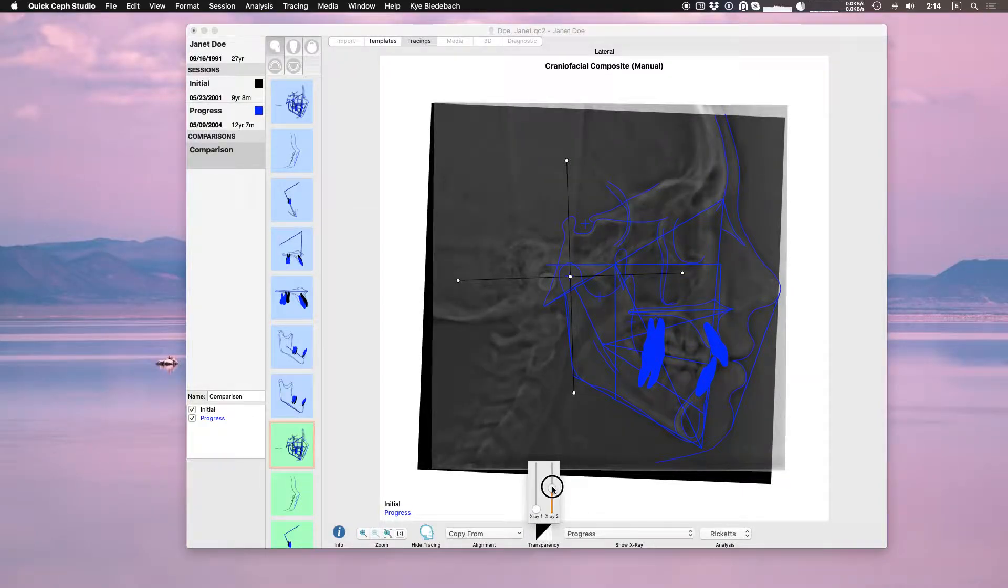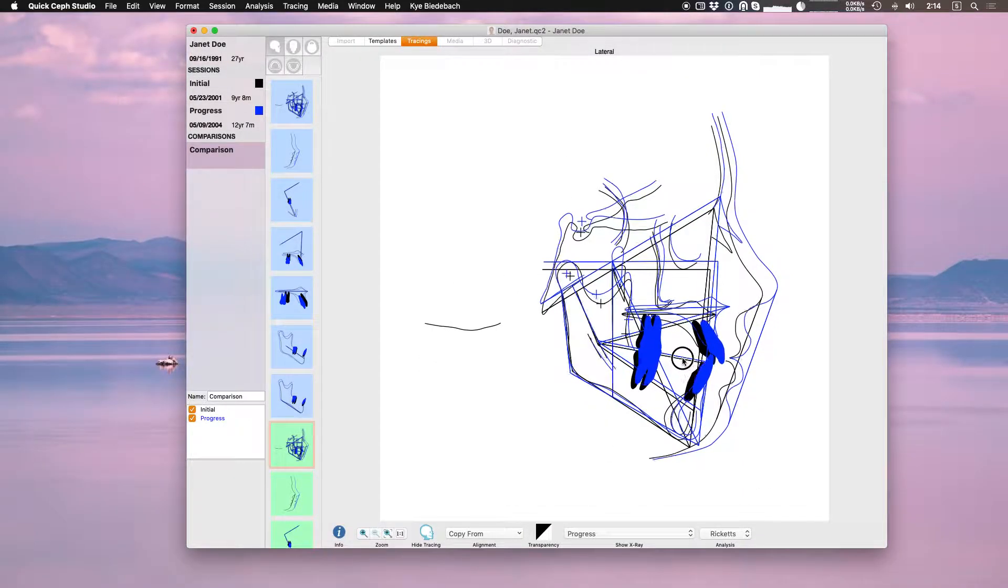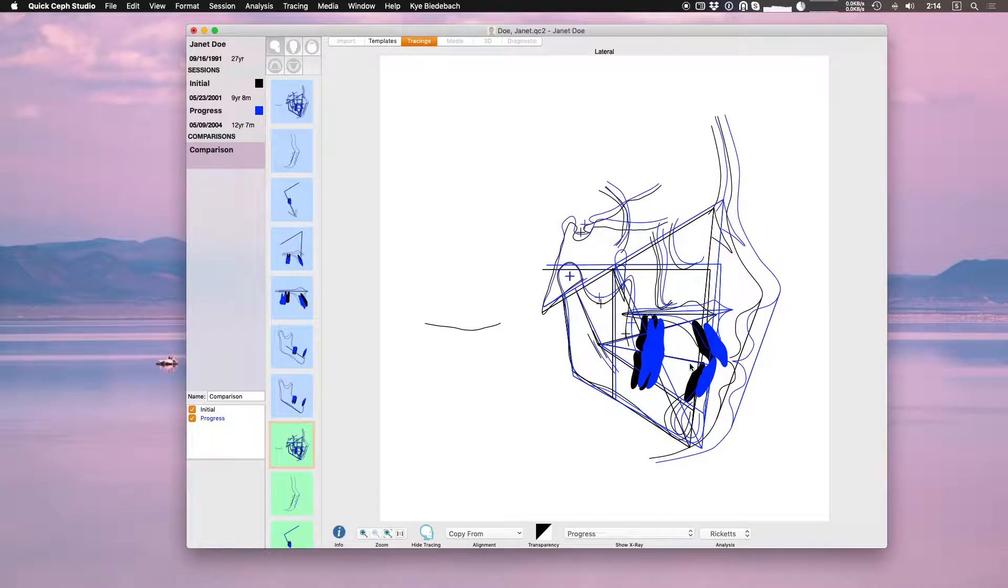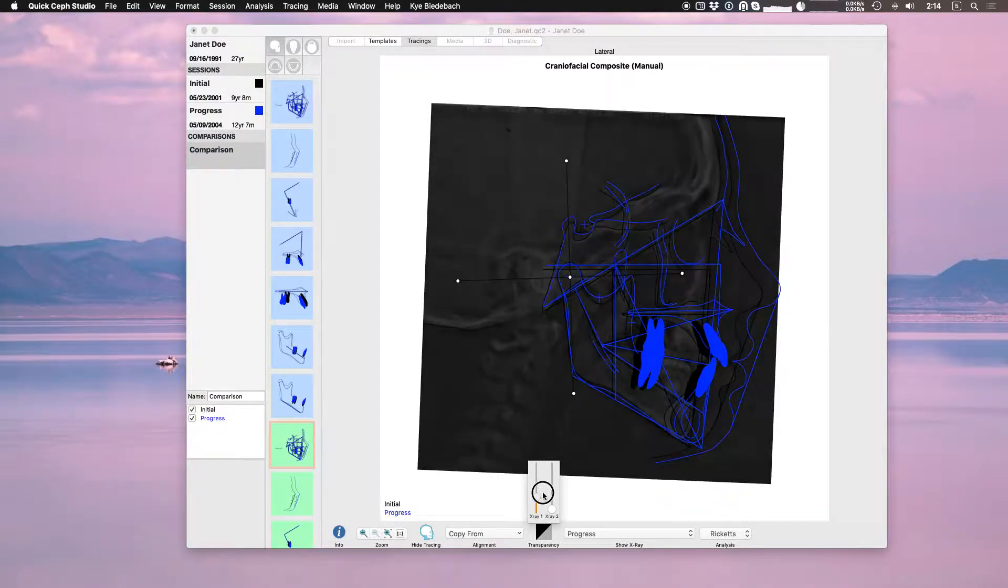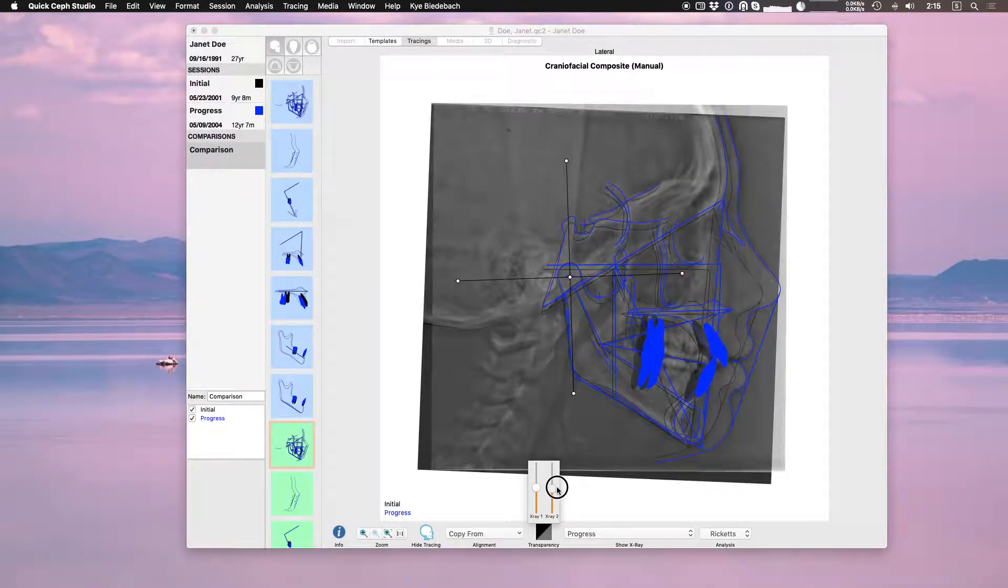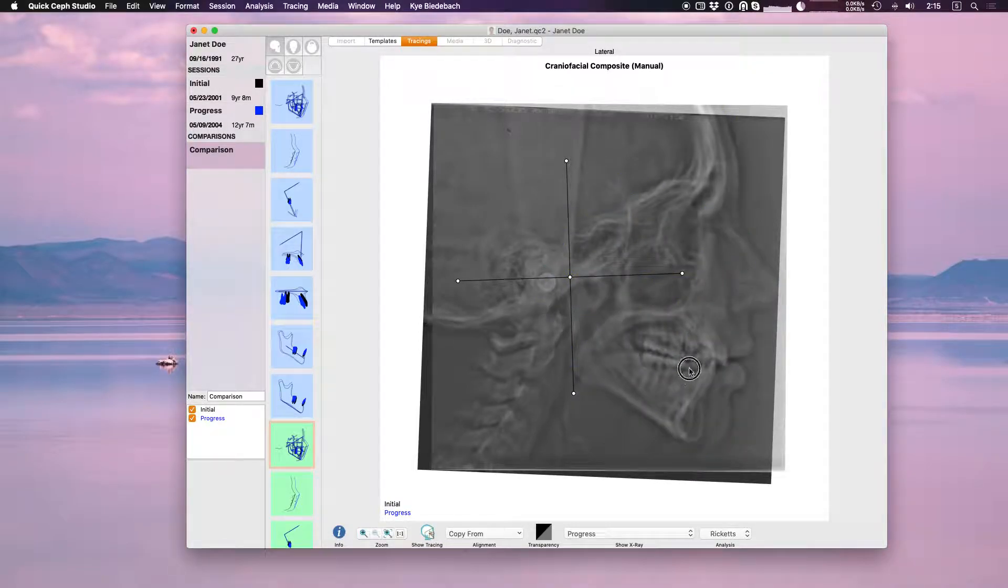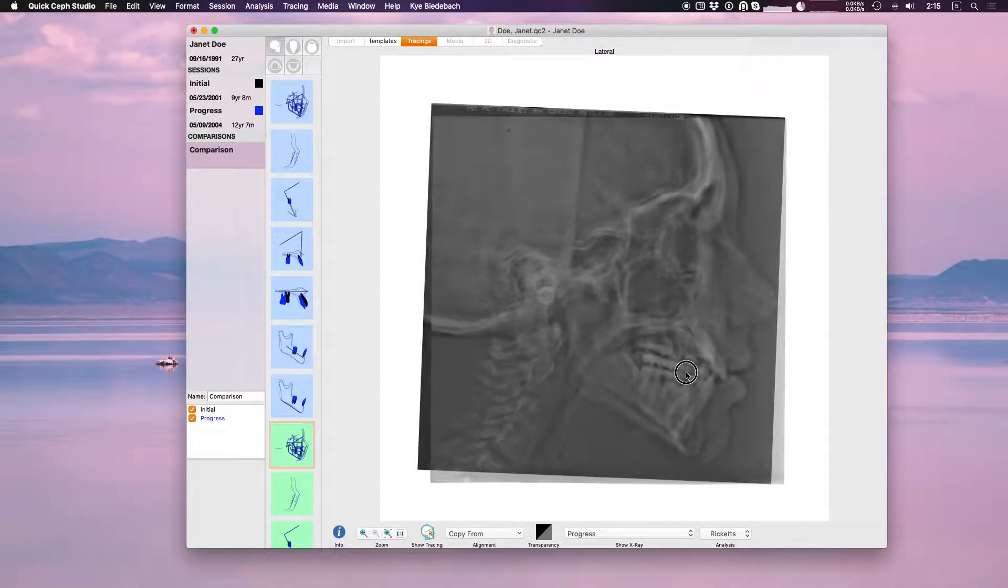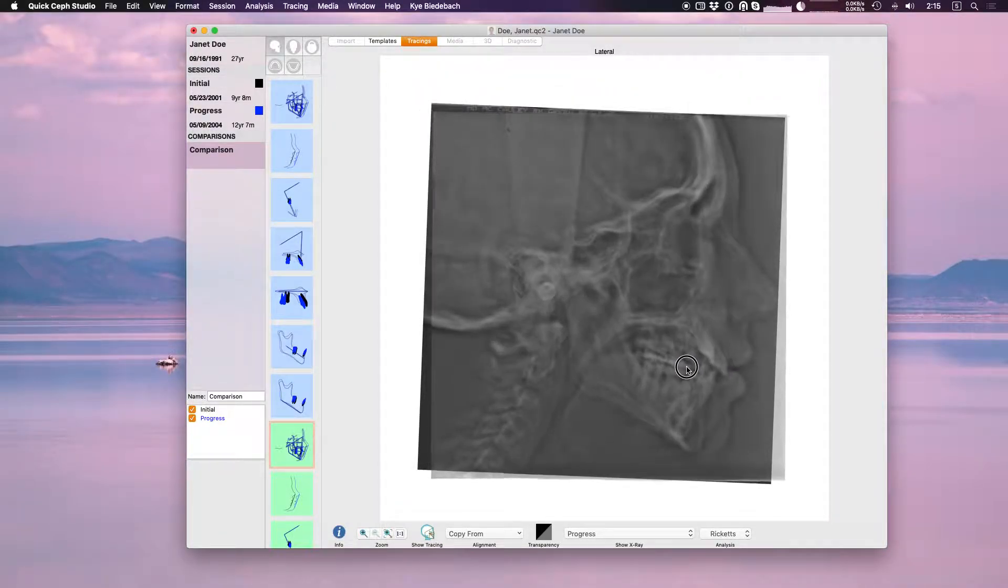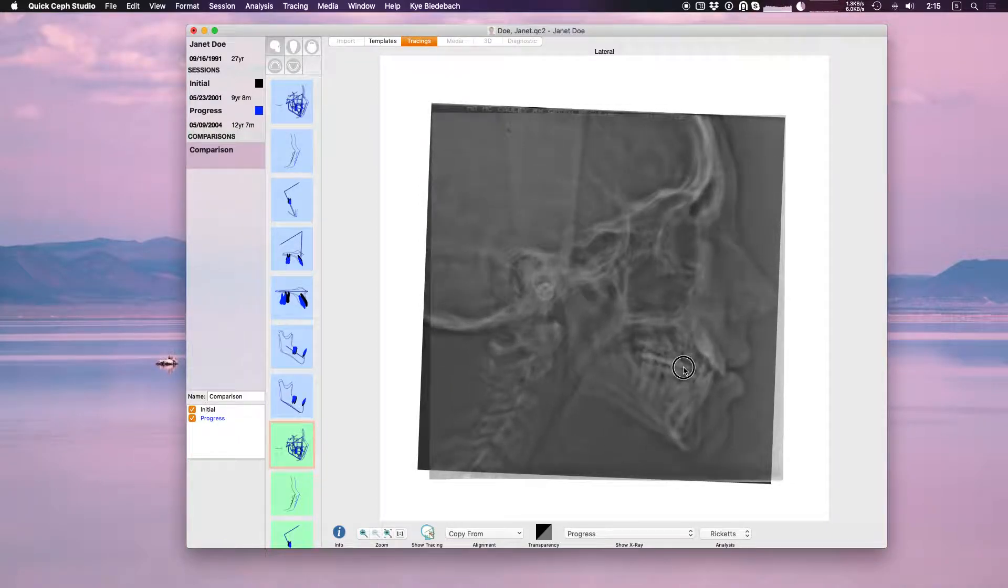If I pull down both transparencies it hides the x-rays and I'm superimposing just tracing on tracing. If I go back and show the x-rays again I can hide the tracing and now I'm superimposing x-ray on x-ray. This is the Bjork structural superimposition method.